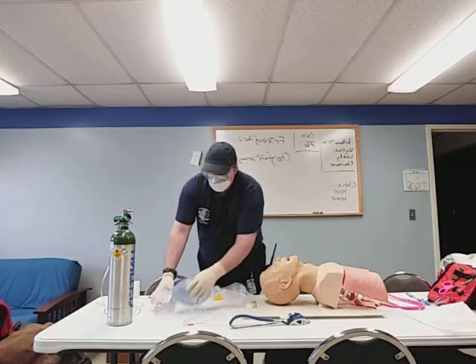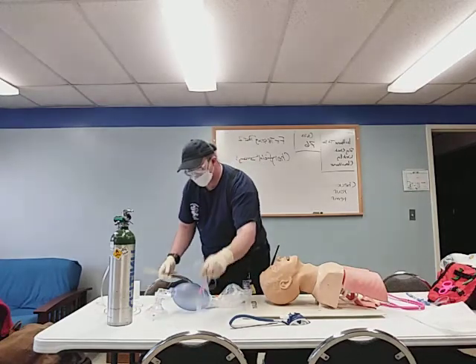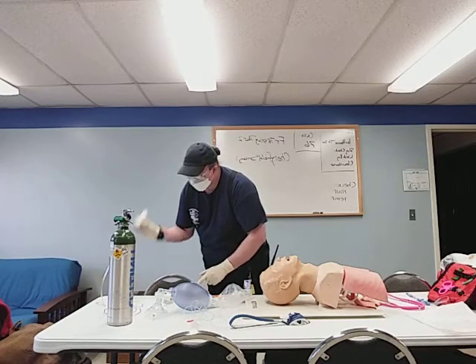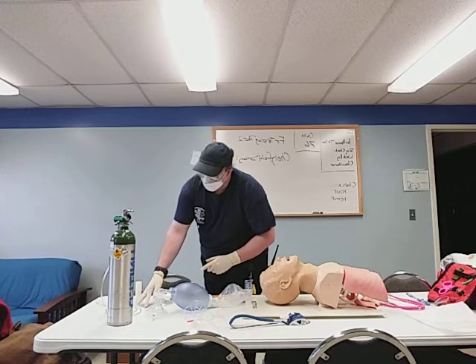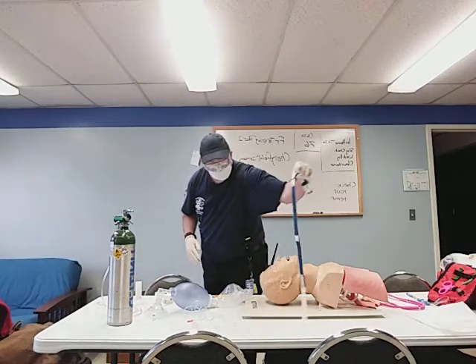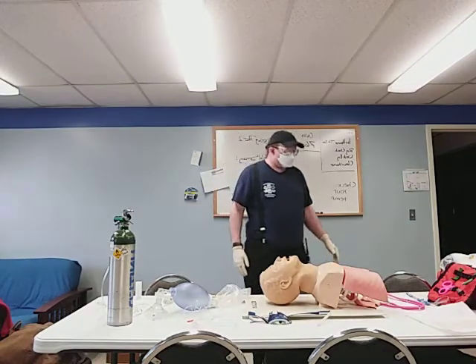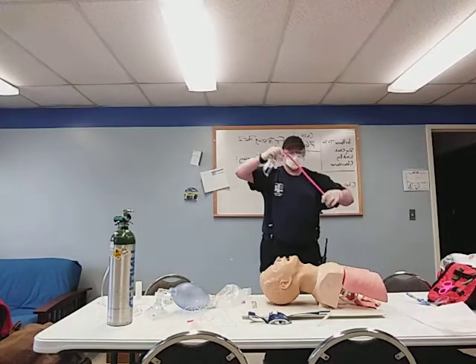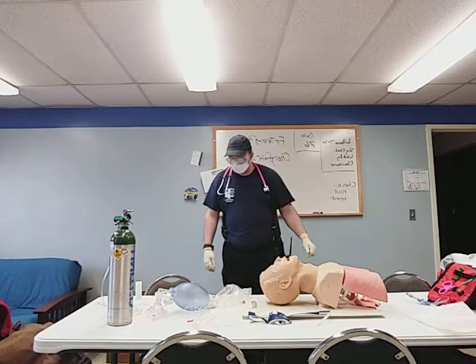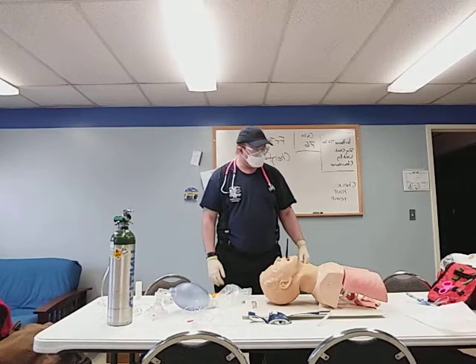OPAs, bag valve mask, just checking my equipment. Capnography attachment for the monitor, LMA, syringe for inflating it, lubricant, which I have already applied, and oxygen, and a commercial securing device for the tube. And most important, not least, my stethoscope. So, let us begin.